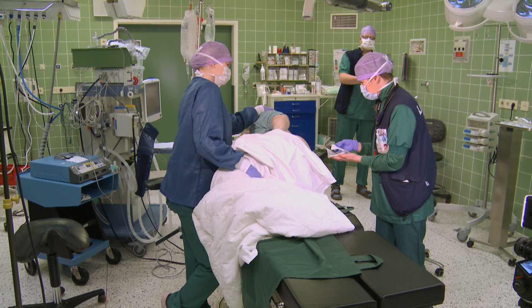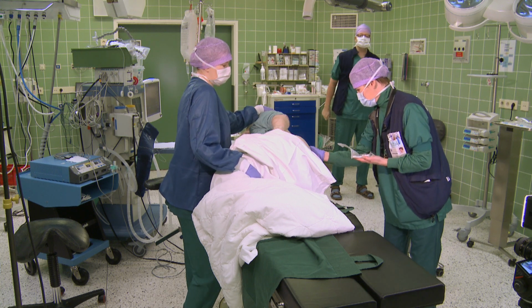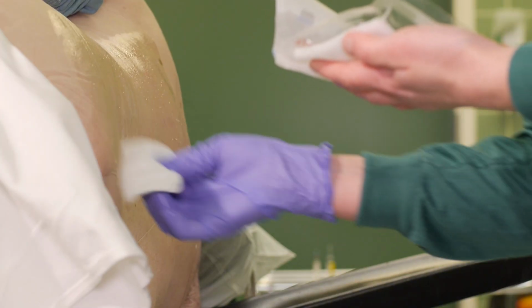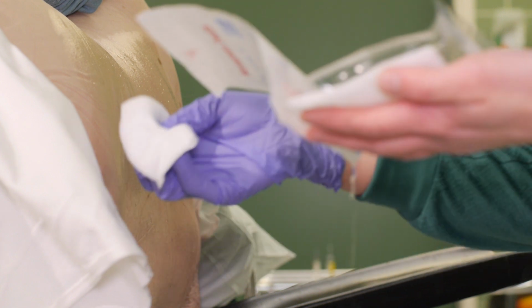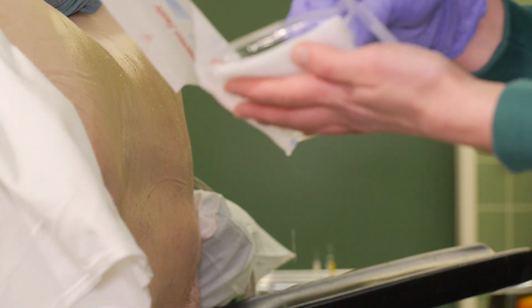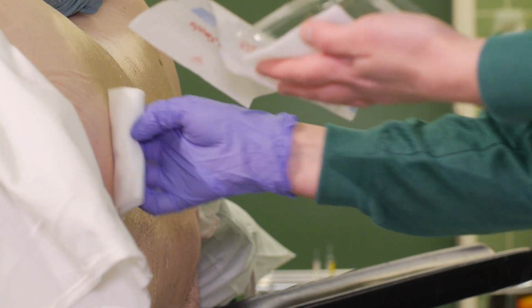The operative area is cleaned extensively from the scapular level to the buttocks to avoid any contamination of the gloves or the equipment. The cleaning is done from up to down and at least twice. The first area washed will be considerably larger than the second.